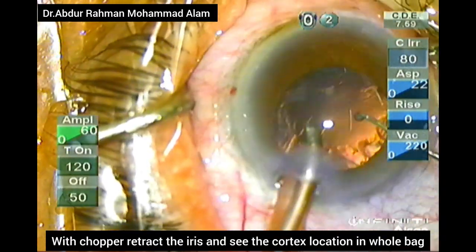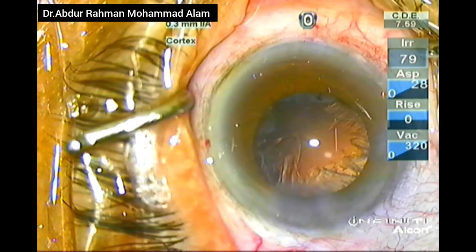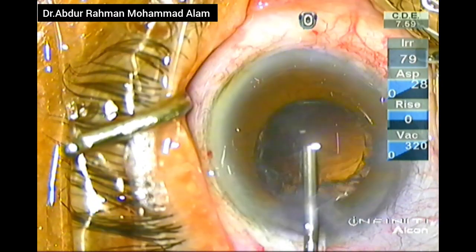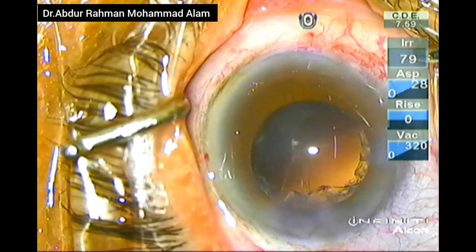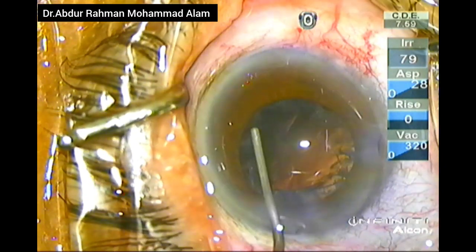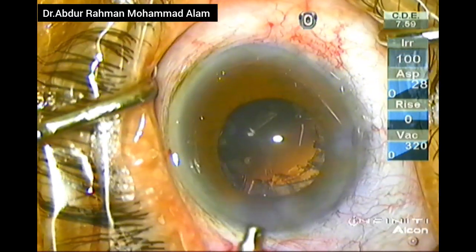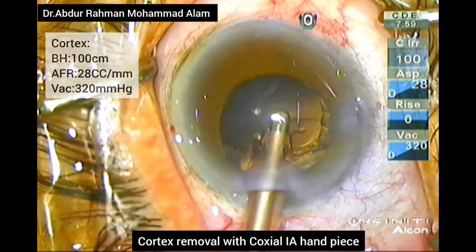With the chopper, retract the iris and see if there is any remaining epinucleus and note the location of the cortex, which will help in visualizing the presence of cortex during cortical removal. A little bit of adrenaline was given because I was feeling that the pupil was constricting.